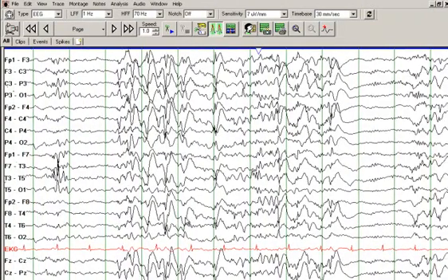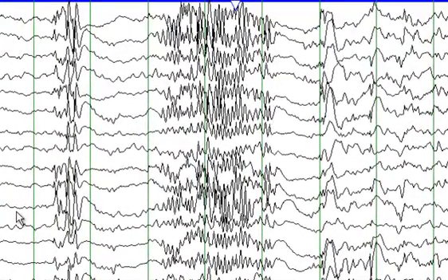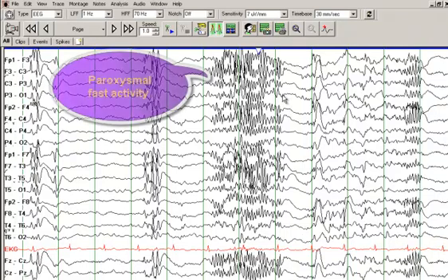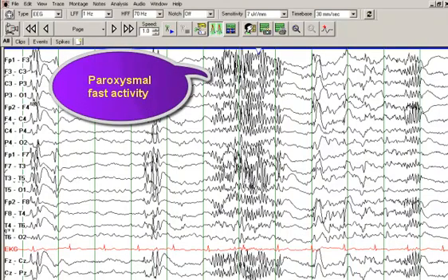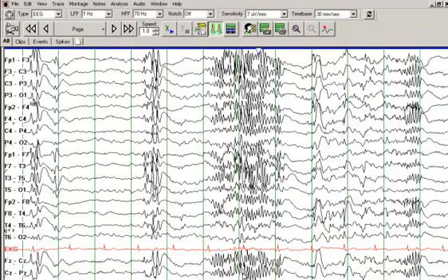This is another run of interictal EEG. You see generalized slowing but also independent sharp waves in the left parasagittal and left temporal head region. Another characteristic finding in patients with Lennox-Gastaut syndrome is these generalized discharges seen in non-REM sleep, called paroxysmal fast activity. Although this is considered interictal epileptic activity, some publications where electrodes were placed on the paraspinal muscles showed subclinical motor activity in association with these paroxysmal fast activity, raising the question of whether this represents an interictal or ictal phenomenon.